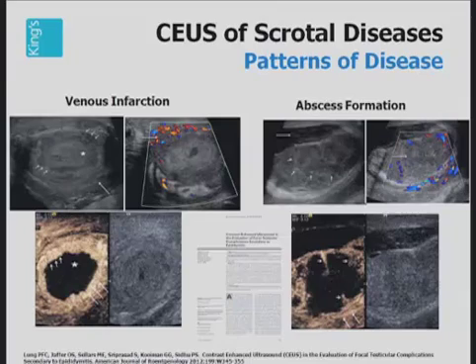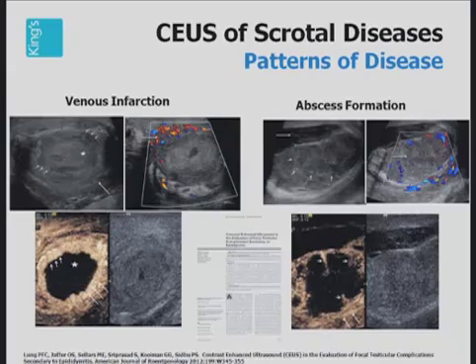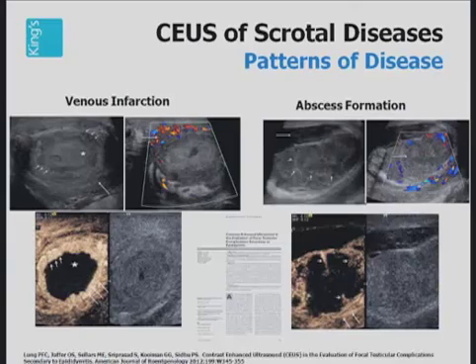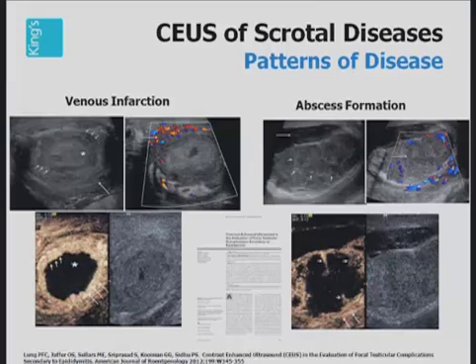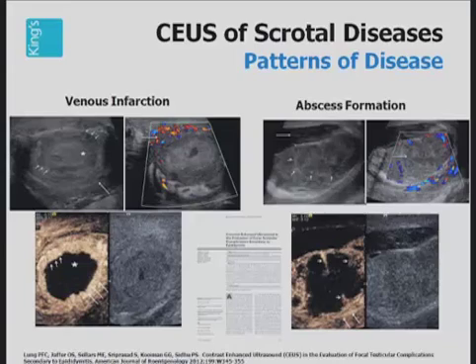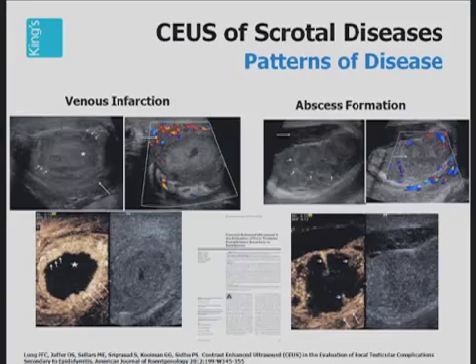These are two patients with entirely different abnormalities in the testes as a result of very severe inflammatory change. In the first patient, there is thrombosis in the vein in the spermatic cord and there is venous infarction in the testes. Contrast-enhanced ultrasound shows that the border is well delineated, there is peripheral enhancement and no internal vascularization. This is a venous infarction.